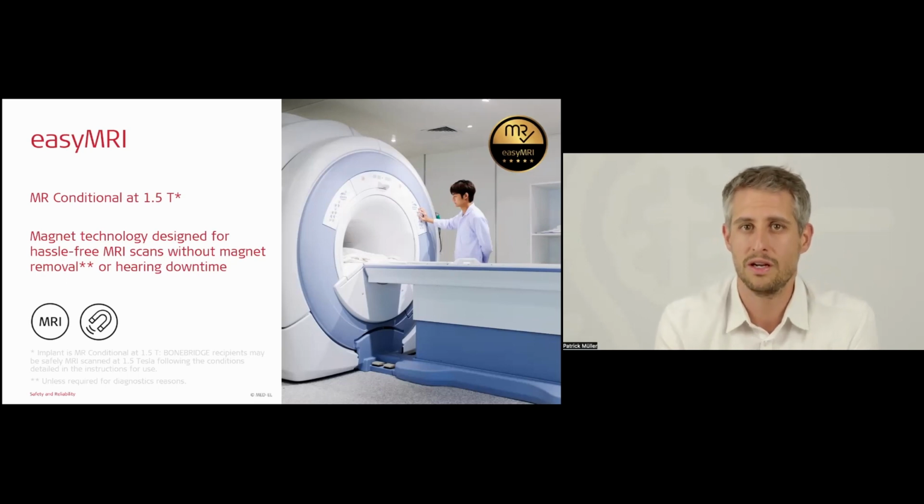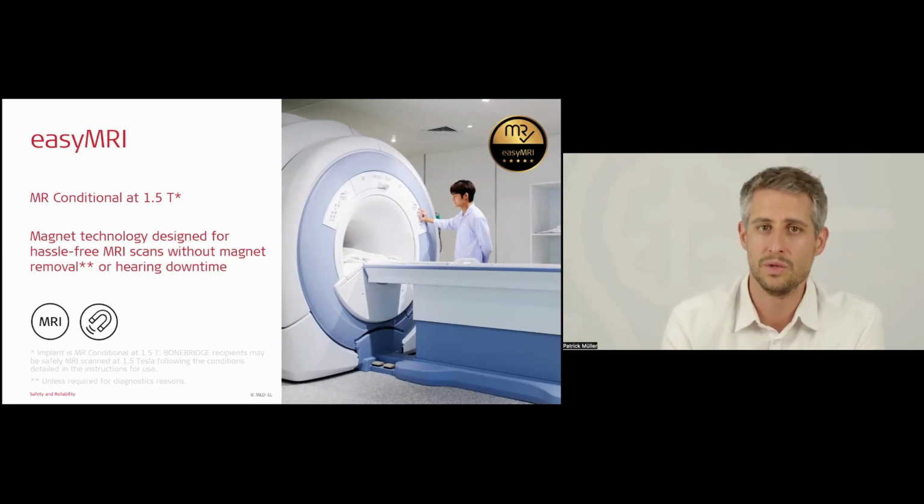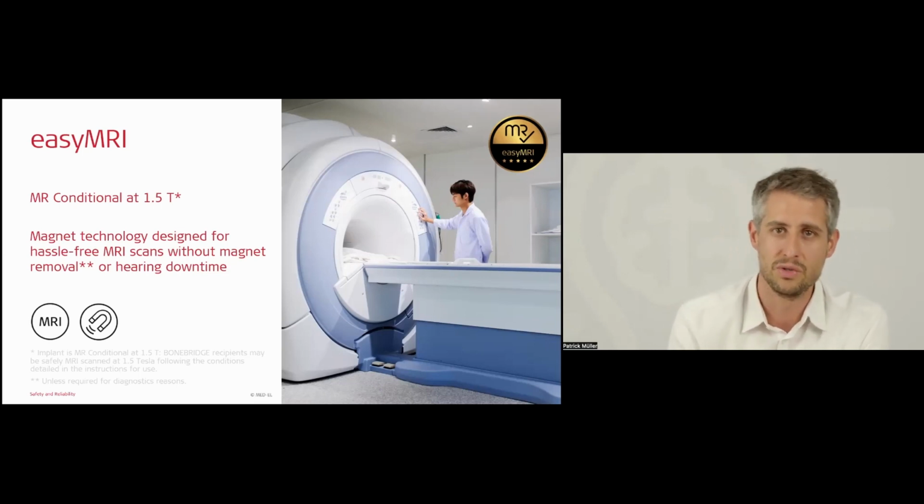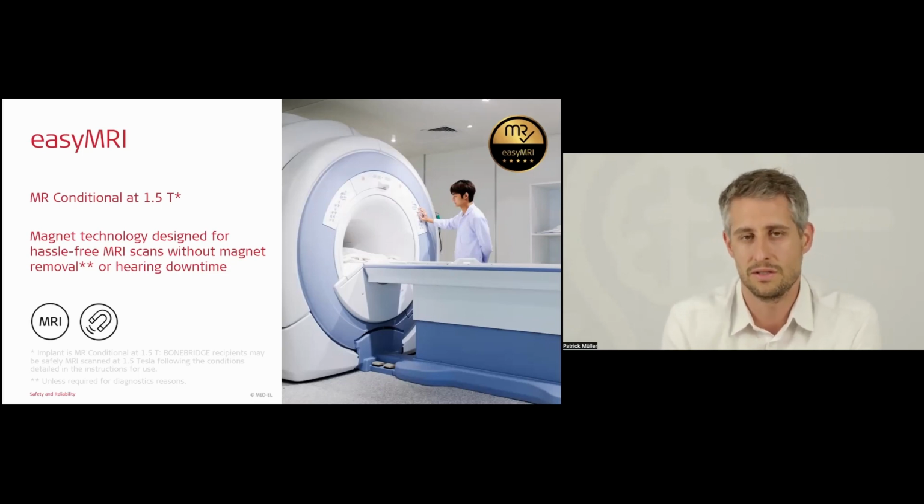We are very sure about our MRI conditionality, and this is why we have this MRI guarantee. We have a lifelong guarantee. So if something would happen during an MRI, we provide new implants because we are so sure that there won't happen anything if you do the MRI scan according to our conditions.